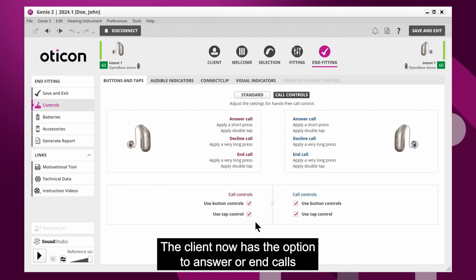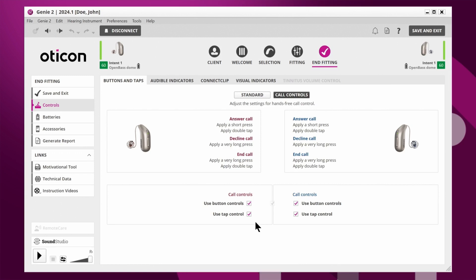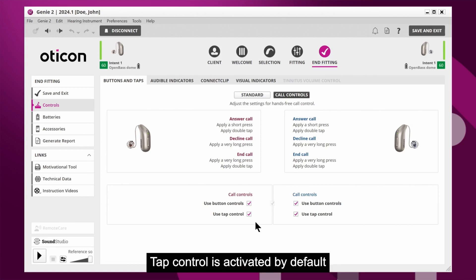The client now has the option to answer or end calls using tap control on their hearing aid. Tap control is activated by default and can be deactivated here in Oticon Genie 2.